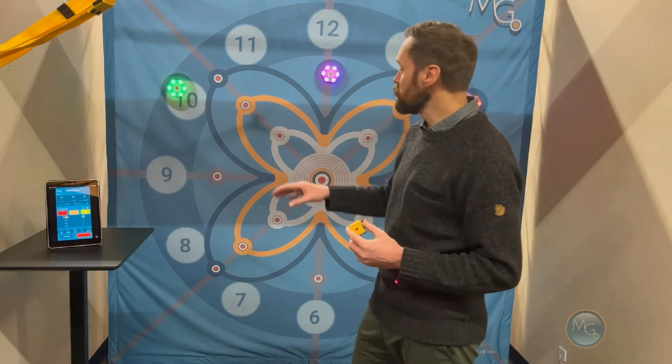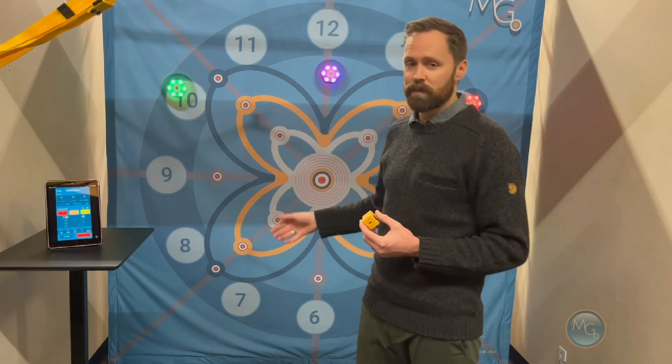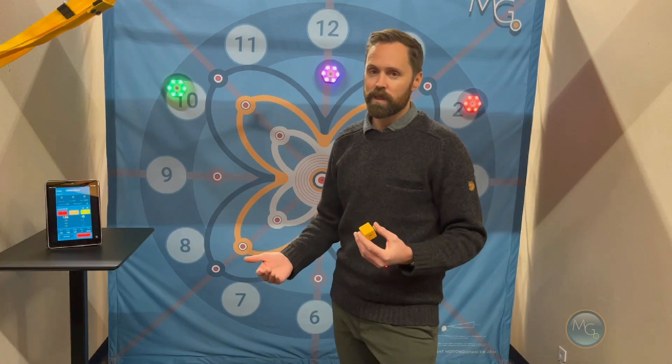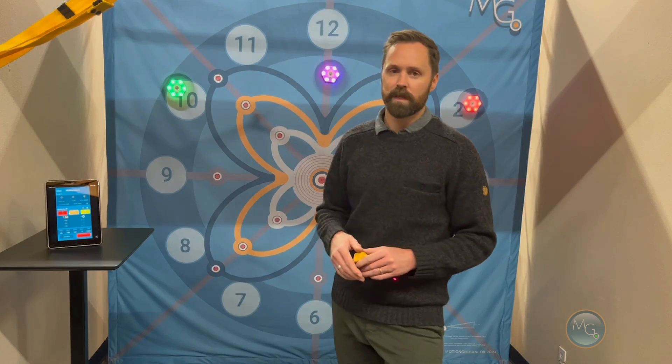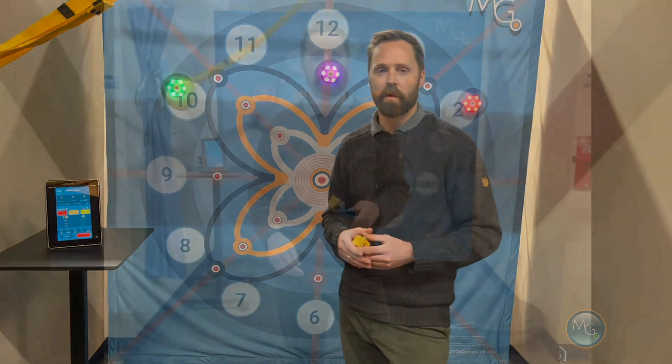You can add challenge by using many more targets. I've only got three, but you can use up to 10 targets with this system. You can also change the speed at which they appear. This is one of the ways you can use the Motion Guidance interactive system for more of a cognitive task, and we have many more games that come on our app.